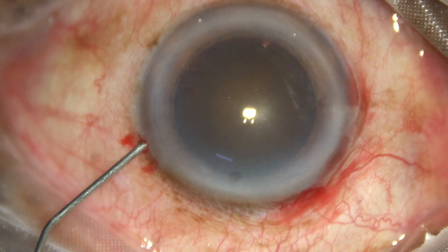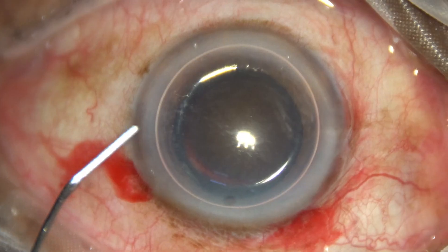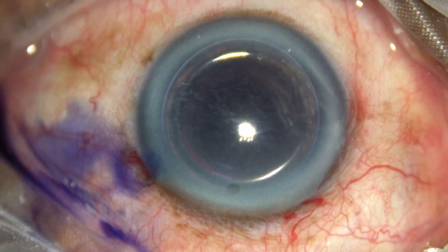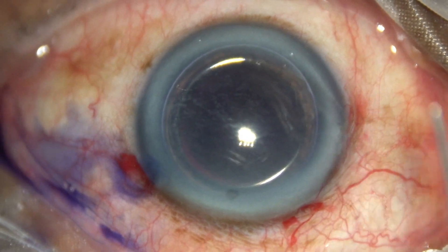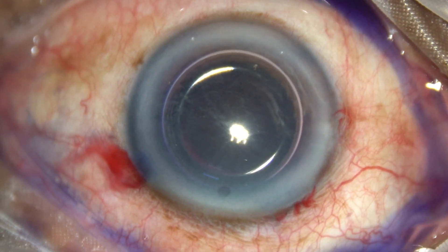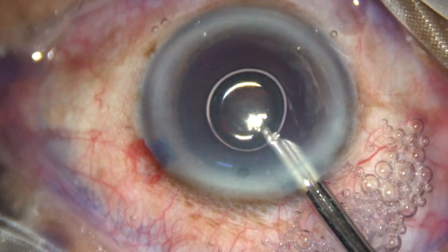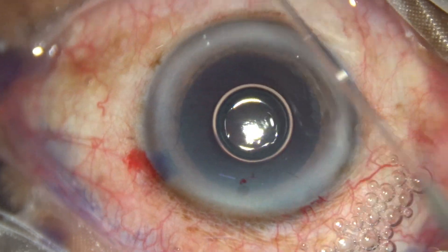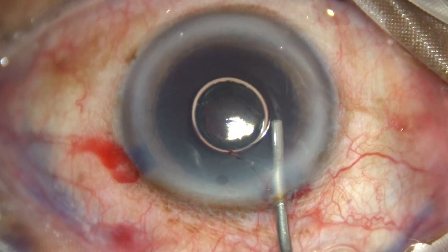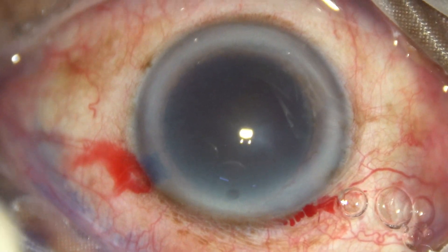The anterior chamber is filled up with an air bubble and then trypan blue dye is applied over the anterior capsule underneath this air bubble. A bit of adrenalin is added, and then the dye is washed out with a 23-gauge Simcoe cannula. The anterior chamber is then filled up with two percent hydroxypropyl methylcellulose.